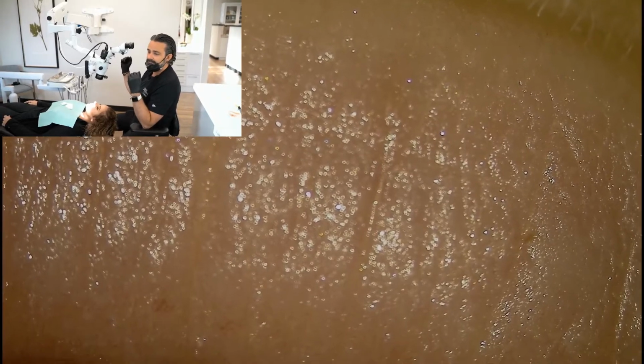I have a question when you're ready. It's something that you can control your focus. So when I'm not touching it, things stay still. So there was a question? Yeah, Alex said, could you explain how you place patient's head depending on the arch you're working on?